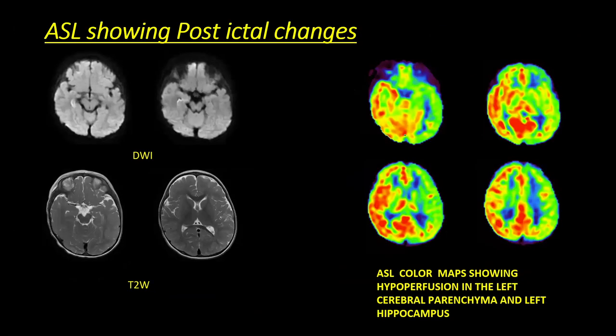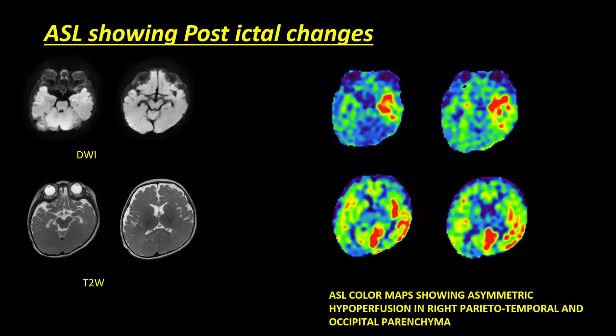Another example: diffusion and T2-weighted images look almost normal, but on ASL color maps there is a clear difference between the right and left, with hypoperfusion in the left cerebral parenchyma representing post-ictal change. Another example from the pediatric age group — T2 and diffusion normal, but ASL showing clear hypoperfusion on the right, which also correlated with the ictal focus on EEG.